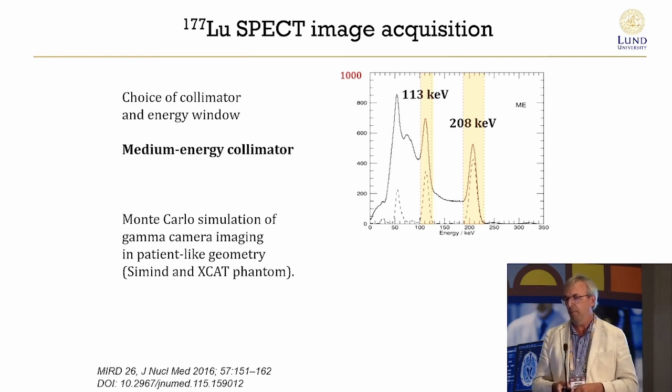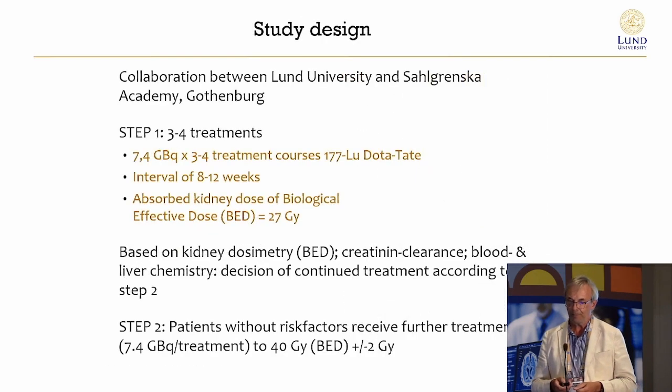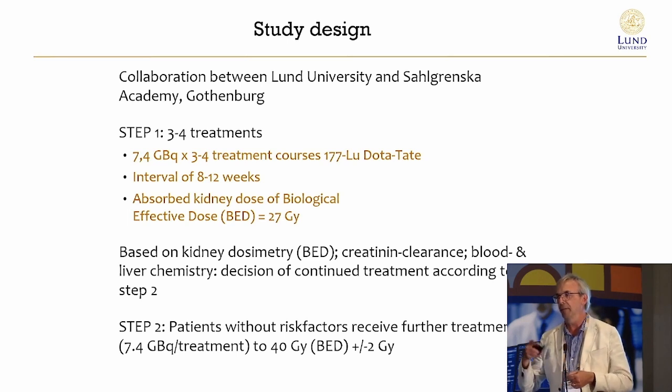It emits two peaks, and we have been using only the higher peak, because the corrections are a little bit easier, and because we have quite a large activity, we can afford not to use both peaks, since we still have relatively good counting characteristics.